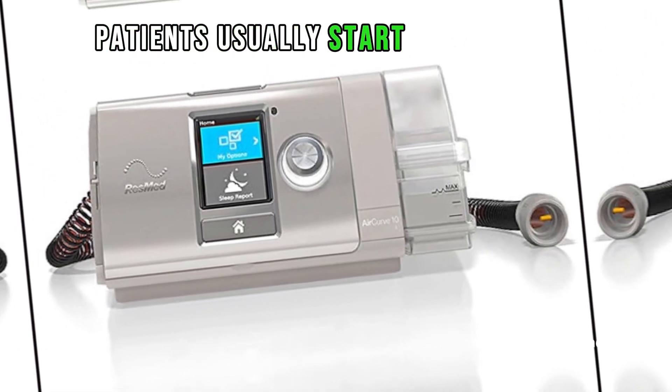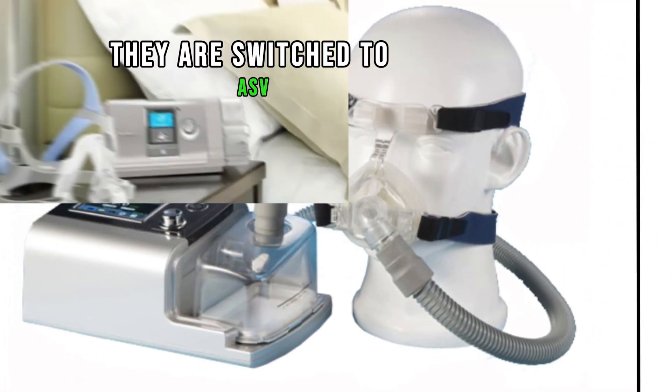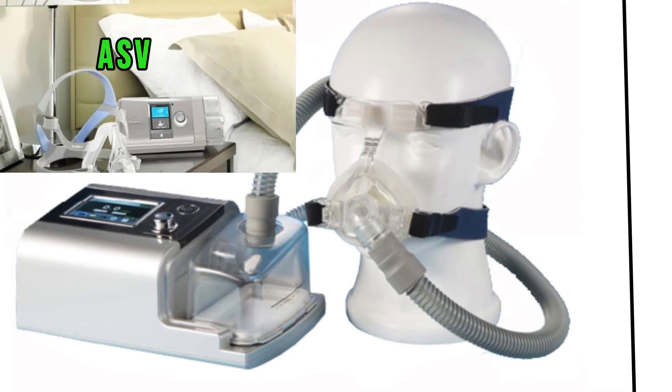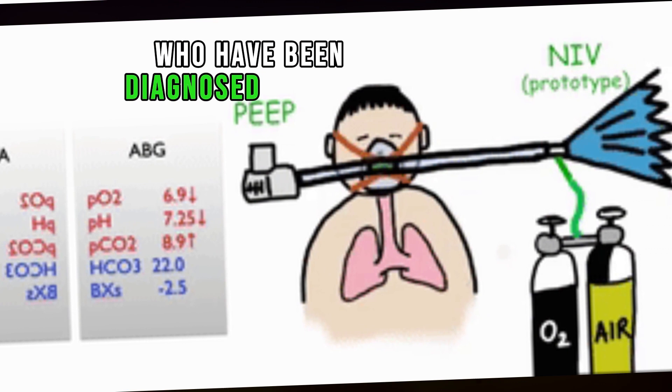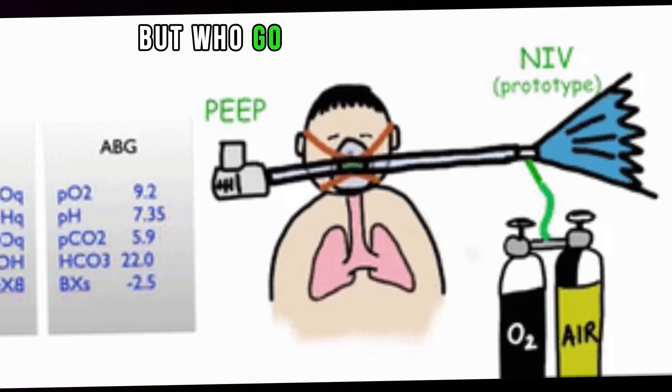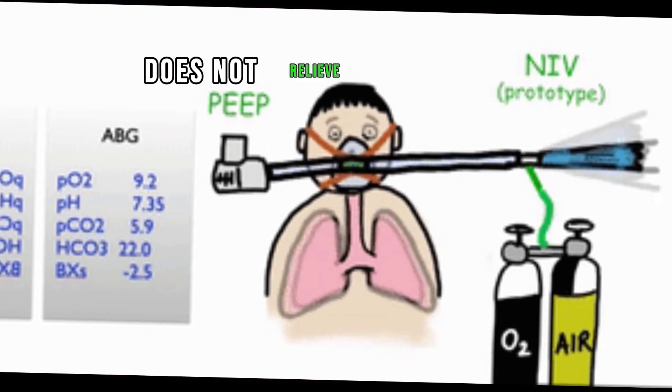Patients usually start on BiPAP for this condition, but if this therapy doesn't work, they are switched to ASV. ASV machines are also used to treat patients who have been diagnosed with OSA but who go on to develop patterns of CSA that bi-level PAP does not relieve.